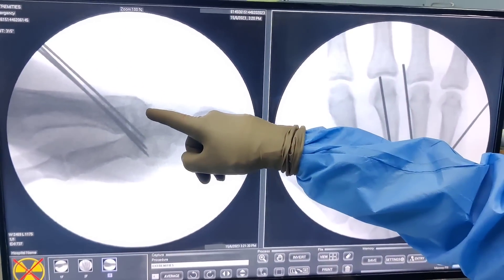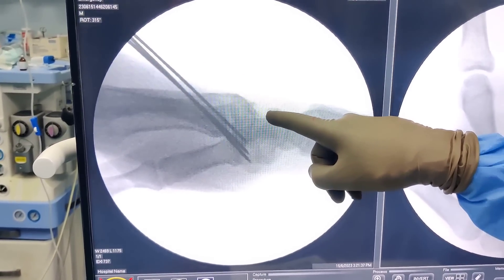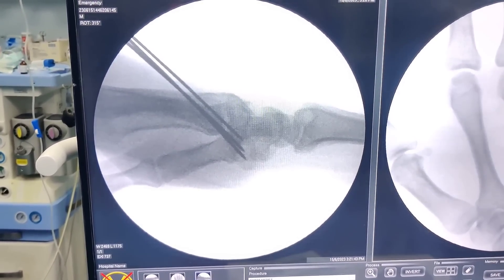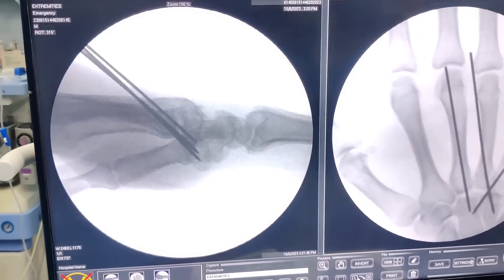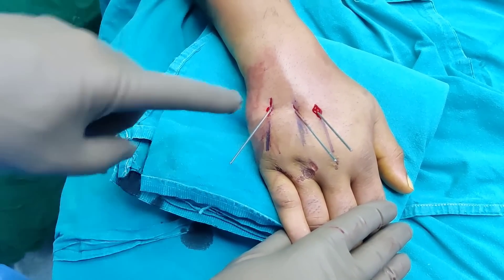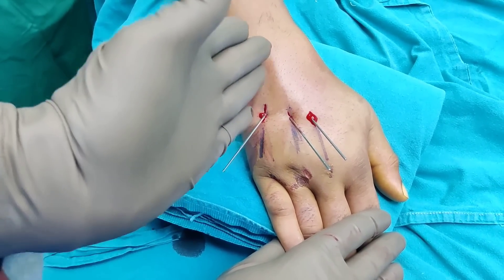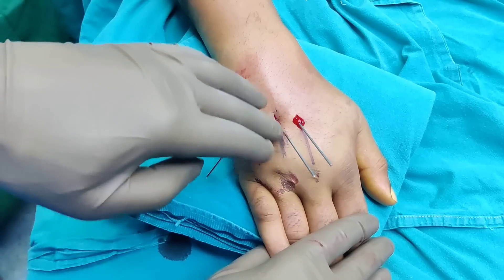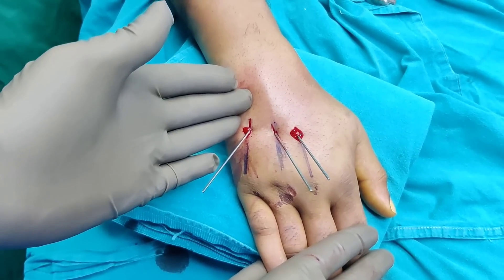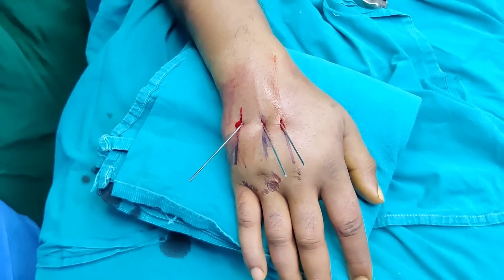The key point is that your starting point should be a few centimeters proximal to the joint — otherwise you will keep skidding or even if you reach the right position the wire will not get a good hold. I am quite happy with this fixation. I am now going to cut, bend, and put him in plaster for around 6 weeks. Just to reinforce: the fifth metacarpal wire goes at a slight angle — roughly 15 to 20 degrees from the direction of the metacarpal — while the others can be fired pretty much straight. These two wires go at different angles, and the one for the fifth goes obliquely to catch the carpal bones. The operation is done; we will bend and cut the wires and they will come out at 6 weeks.